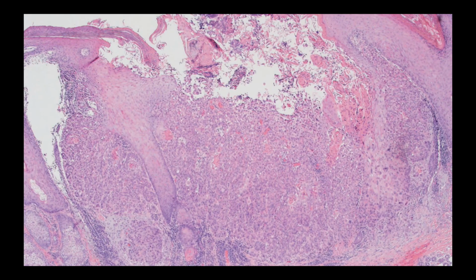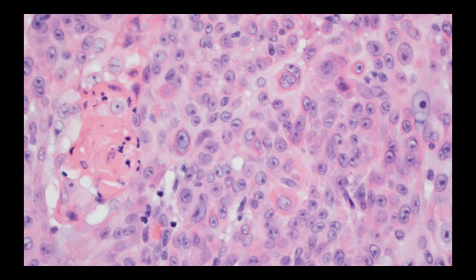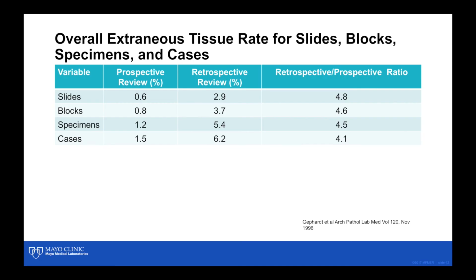So here's the squamous carcinoma. It was a squamous carcinoma of the face, and you can see that there's a fairly poorly differentiated squamous carcinoma, but there are areas of recognizable squamous differentiation. There's a nice keratinized cell centrally there. And this just shows a very similar look to what we had on that piece of tissue. And I'm in the process now of proving that this piece of tissue belongs to the piece of tissue in the block. This is from case 6 last year, which was a floater, which many missed last year, so you may want to take a look at that.